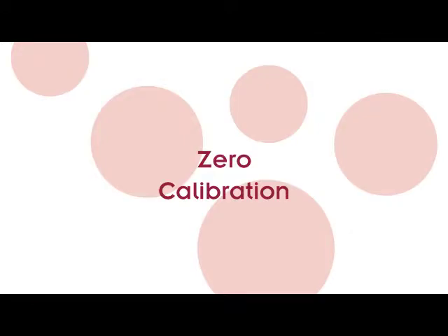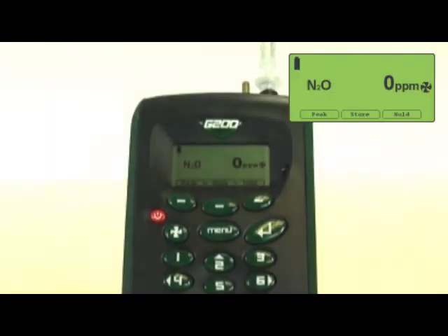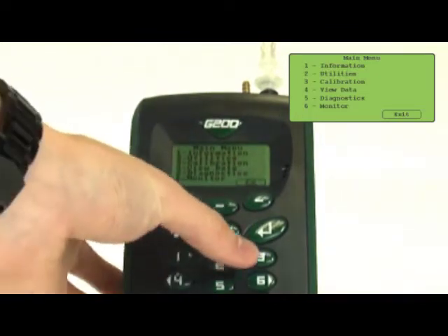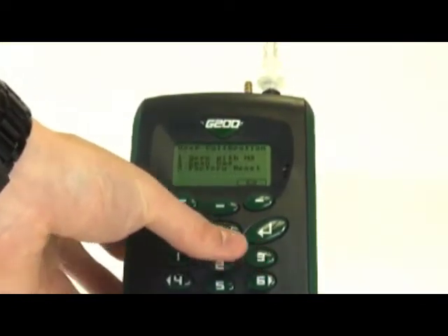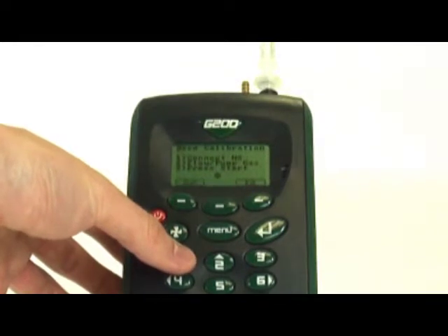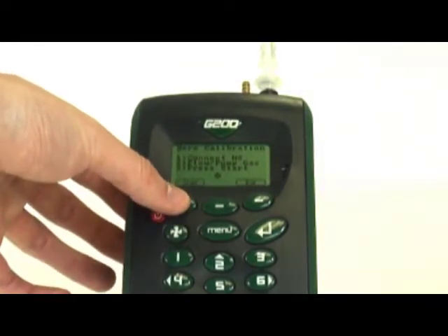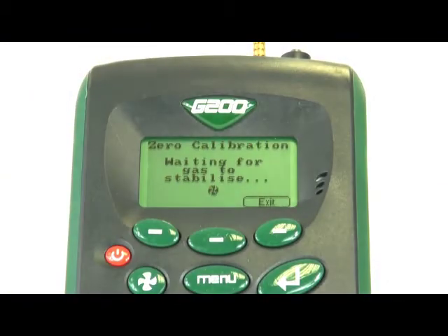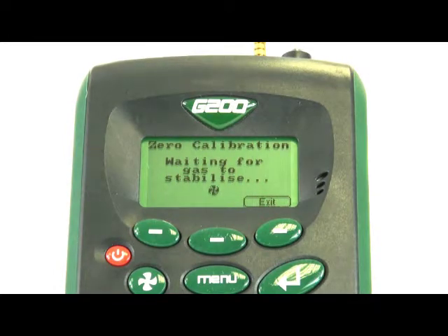Zero calibration. A zero calibration is to be done in ambient air away from any levels of N2O, and the CO2 lime filter must be attached. To begin this calibration, select the calibration option from the main menu and then select zero calibration. The monitor will begin to zero calibrate upon pressing the select button. Once the G200 has completed its zero calibration process, you can press accept to finish.